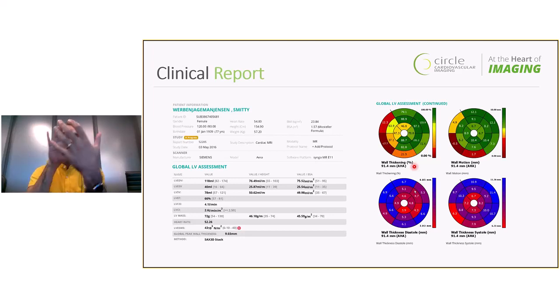If you look at it from the top-down view and flatten it, the cone is broken down into these different segments, and each segment indicates a certain coronary territory or region of interest. By observing it here, we can summarize the 3D deformations happening inside the left ventricular muscles in this simple 2D static visualization. This is essentially what follows all of the biomarker extraction that we do.